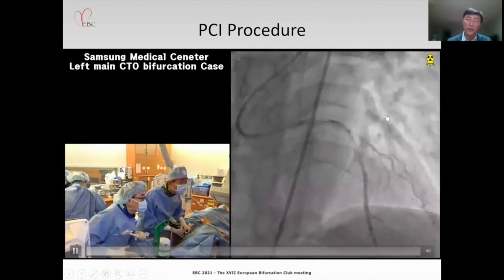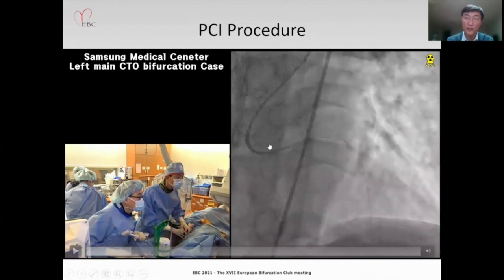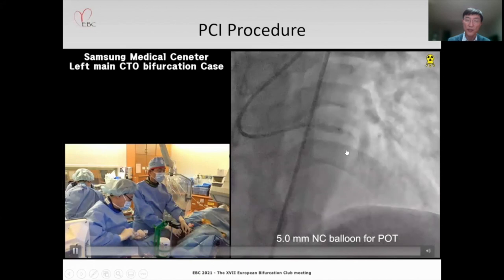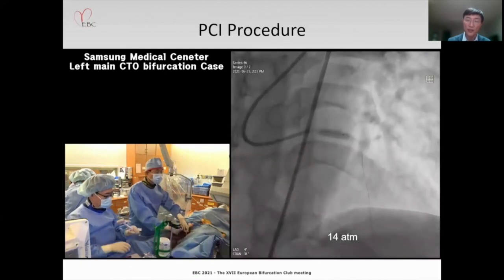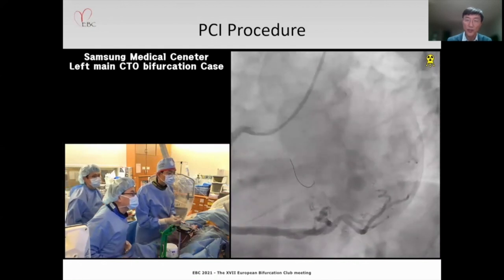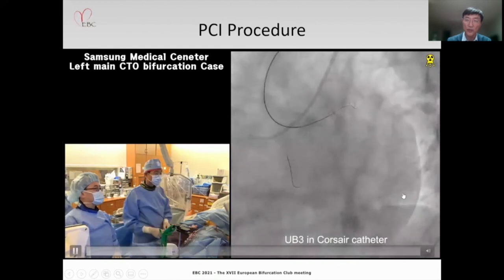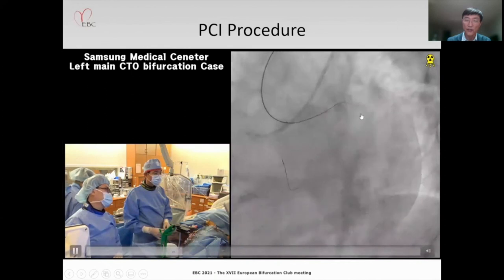But we know the location of the circumflex ostium, so we can try wiring here. The first thing we should do for the wiring is the proximal optimization technique. So to widen the cell struts in the left main stent, we have a better chance to wire the circumflex ostium because of wider space between stent struts. And this is a contralateral injection. You can estimate the location of the circumflex.